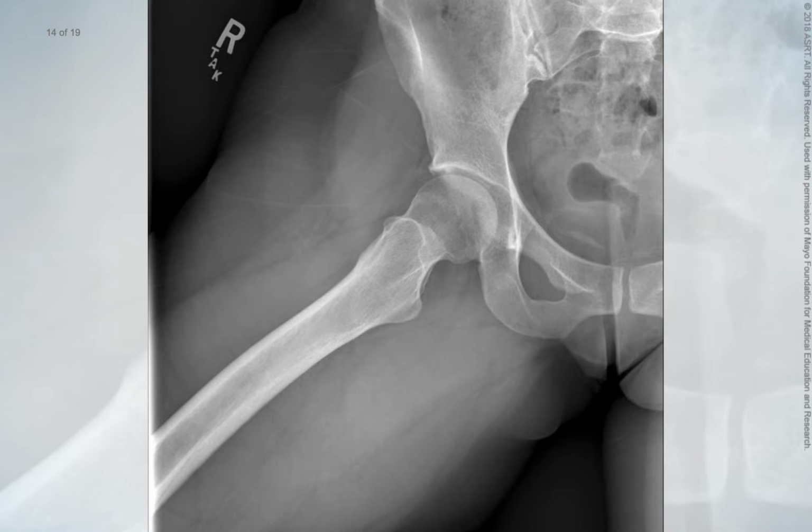The following quality criteria should be used to determine if a lateral hip radiograph has been produced with proper positioning and technical factors. The collimation and gonadal shielding do not obscure relevant anatomy, and the hip joint is in the center of the image. The hip joint, acetabulum, and femoral head are all visible. The greater trochanter superimposes the femoral neck when a perpendicular central ray is used, and the femoral neck is seen without superimposition when the central ray is angled cephalic. Soft tissue and bony trabecular detail are clearly visible.